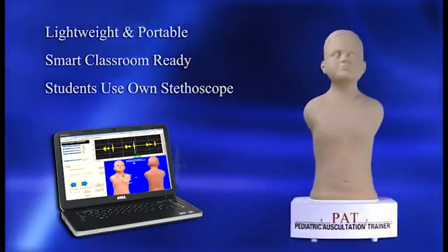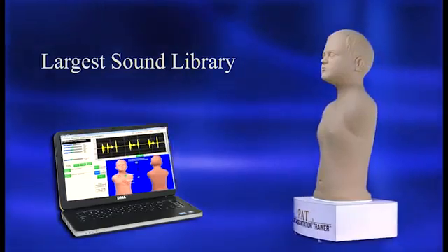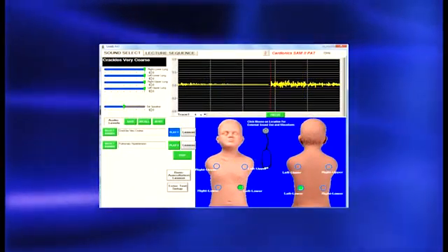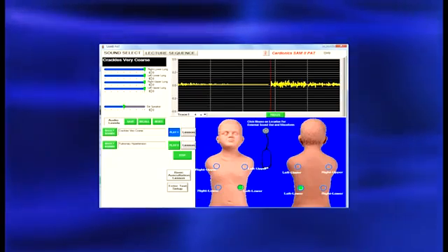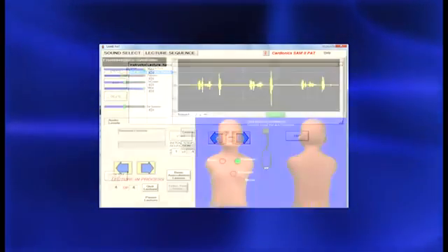Students can use their own stethoscope. With the largest sound library available in any pediatric auscultation trainer today, PAT includes phonocardiograms, sounds displayed at correct anatomical sites, programmable and password-protected lessons, and much more.